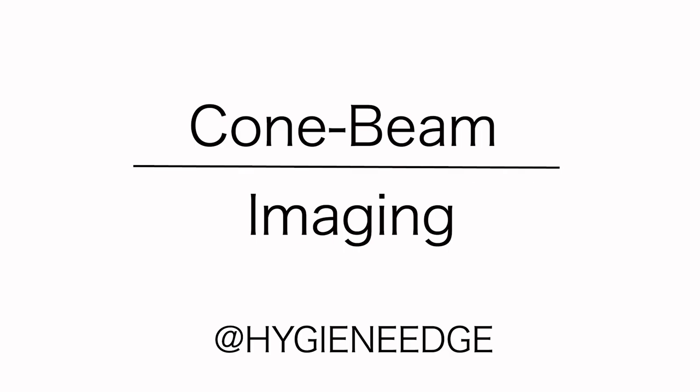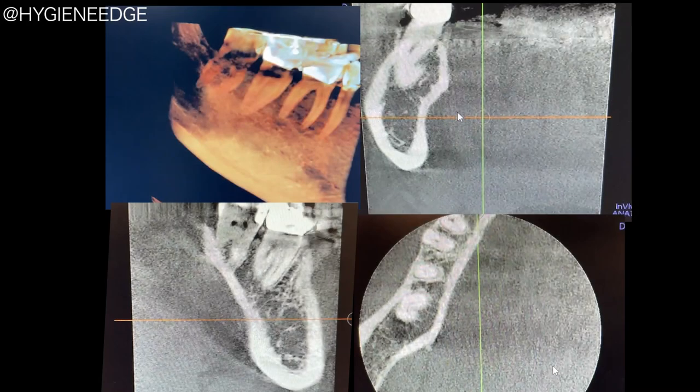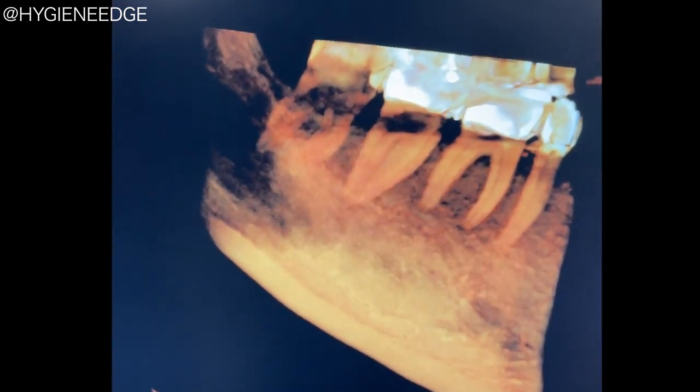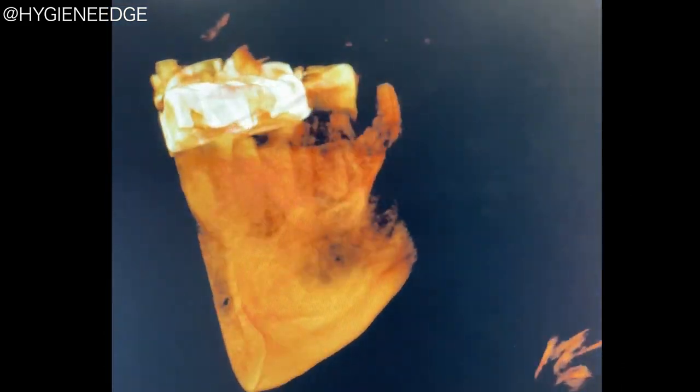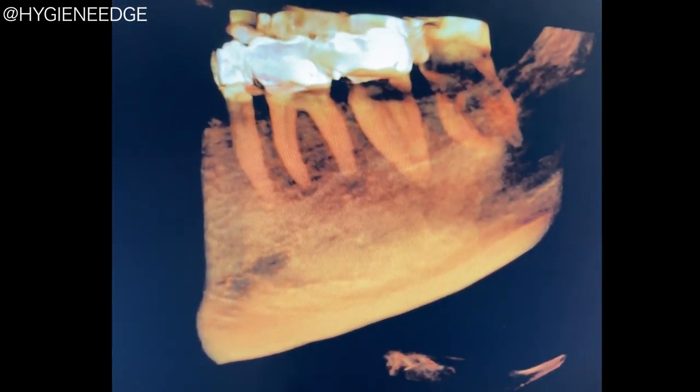A cone beam 3D radiograph produces 500 image slices for each of the three anatomical planes, resulting in 1,500 image slices available for viewing structures in the oral maxillofacial complex in three dimensions.